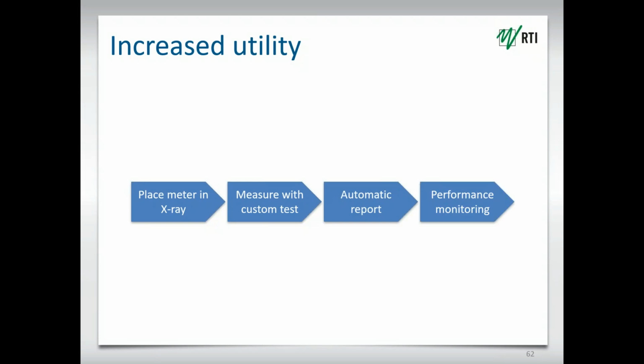We're also seeing here performance monitoring. That is more and more interesting. The possibility of monitoring the equipment to such an extent that we can predict when something is going to happen, when we might need a tube replacement, or they have a degradation of a generator that looks funny.